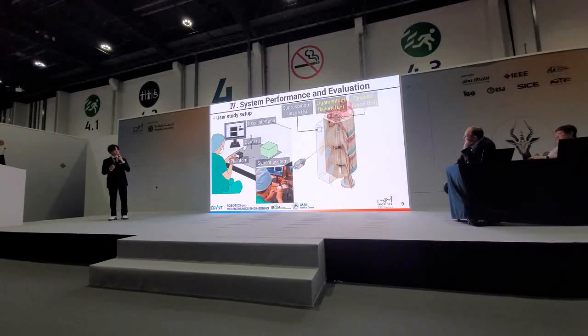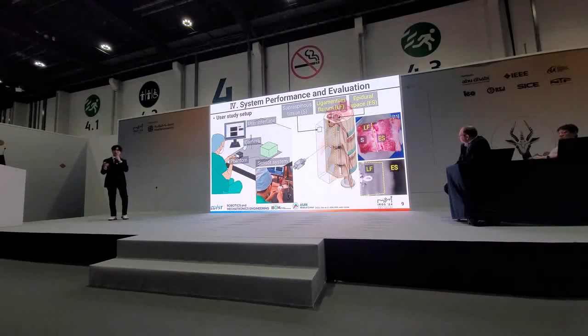As shown in this figure, the needle penetration process is performed according to the actual epidural injection procedure on the customized spinal phantom. This spinal phantom has 3 main sections: supraspinous tissue, ligamentum flavum, and epidural space. A total of 23 interventionalists participated in the user study, and during the study, the force curve was recorded according to the needle penetration process.